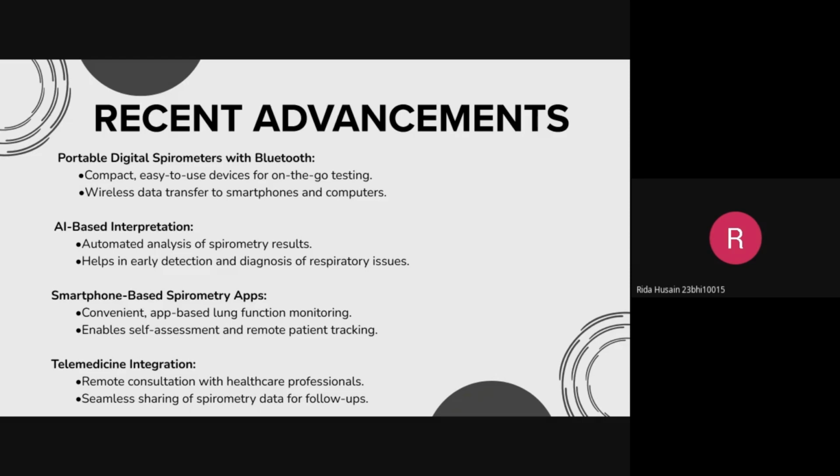Next is smartphone based spirometry apps. They are convenient, app based lung function monitoring. It enables self assessment and remote patient tracking. Next is telemedicine integration, remote consultation with healthcare professionals. It also helps in seamless sharing of spirometry data for follow ups.